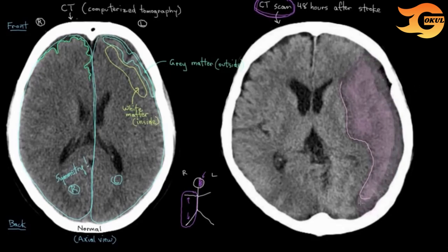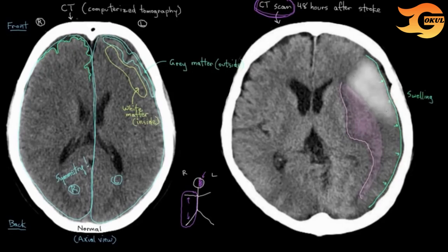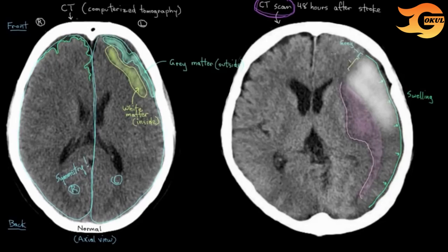A few other things to notice in our stroke brain: the nice, well-delineated curves of the surface of the brain are not really present anymore because of the swelling. The surface of the brain is starting to look pretty similar to what's underneath, in contrast to the normal side where there's good differentiation between gray matter on the outside and white matter underneath. In the brain with a stroke developing, you start to lose this gray-white differentiation — things start to look more the same — and that's another sign of stroke on a CT scan.